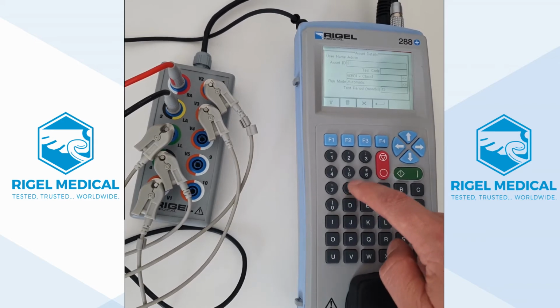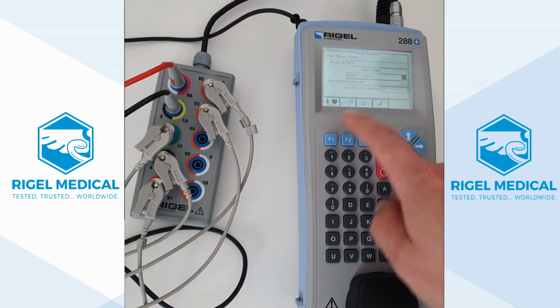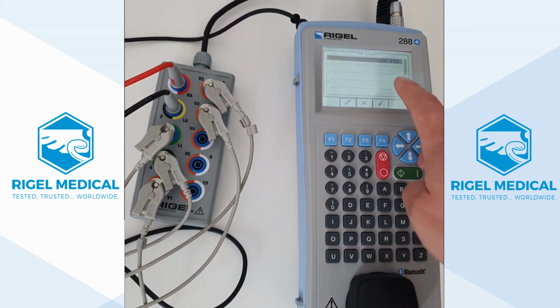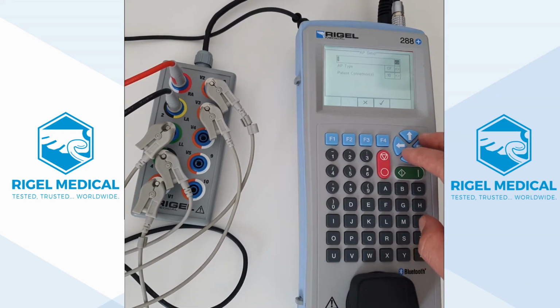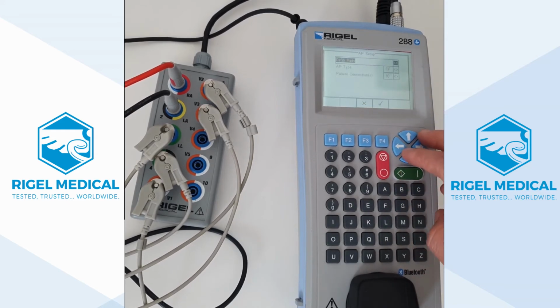we'll key in an arbitrary number for our asset ID. We'll keep it for now as IEC 60601, class 1, and we'll go to applied parts, F1. Now automatically it's set up for the highest classification, CF, for all applied parts 1 to 10. But we're going to change it to defib paddles for the first one. So we've got the titles all listed here. This is BF, patient connections 2.